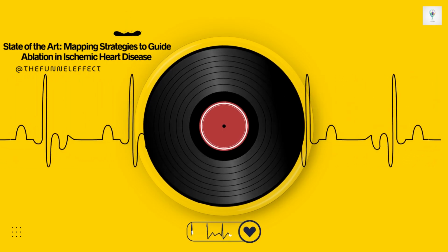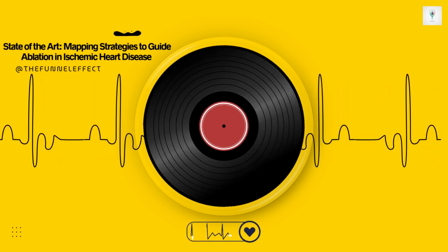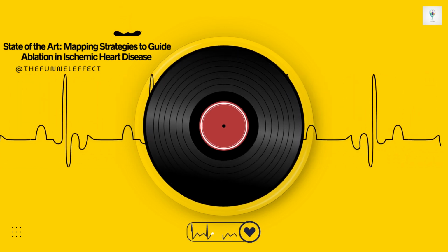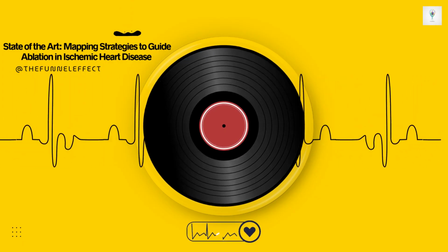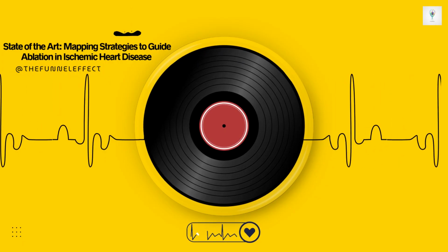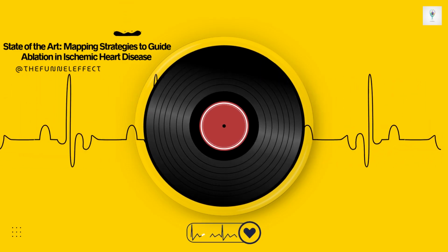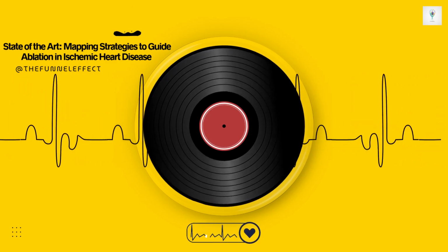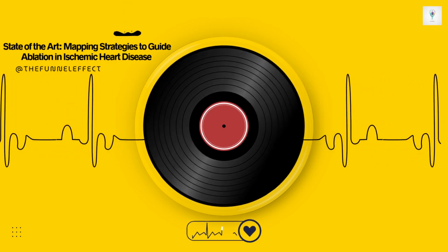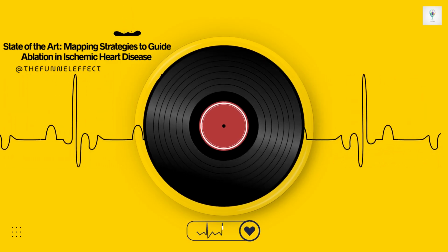But even in these very low voltage zones, down to 0.1 millivolt sometimes, if you try to pace there with the catheter, you can often still capture the muscle. Meaning there are still living cells there. Yes. It proves there are still some surviving myocytes present, even if they're sparse. And if there are living cells, there's potential substrate for VT. It's rarely truly electrically inert. That's why these ultra-low voltage areas often still need to be mapped and potentially included in the ablation.